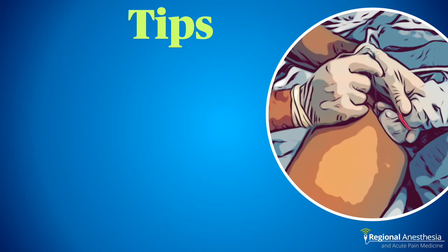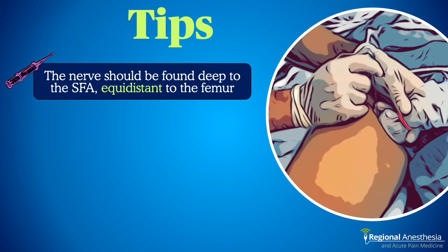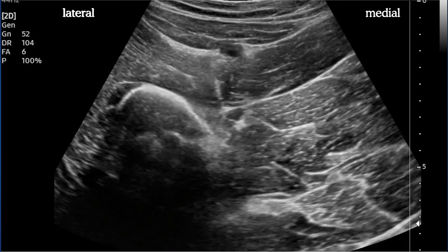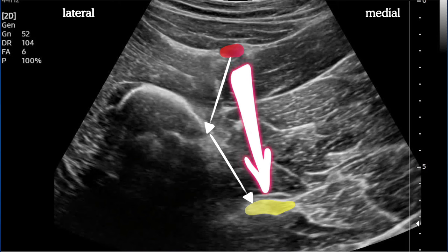Here are some tips for the anterior sciatic nerve block. First, it's great when everything looks amazing on the screen, but that's not going to happen every time. If you're scanning up and down trying to get that nerve to pop out of the background, use this handy rule: imagine a line drawn from the femoral artery to the side of the femur, then go that same distance deeper in line with the femoral artery. You should find the nerve right there, or at least the correct plane.